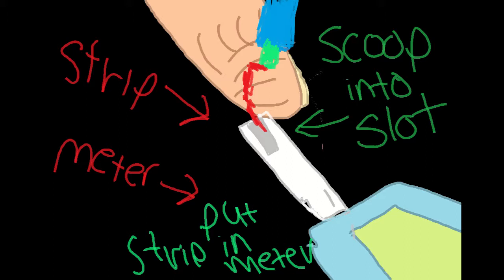And you're going to use that test strip to scoop the blood up, and it's connected to the meter. Now, if you have seen a test strip, you'll know what I'm talking about. If not, once you are practicing in the field, you will know.